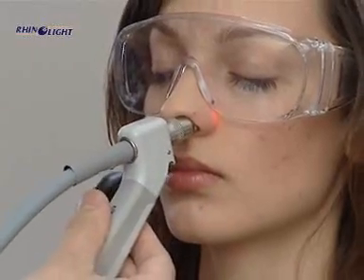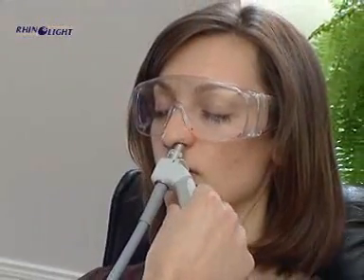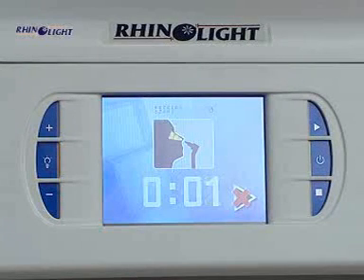During the treatment, the progress can be followed by watching the light shining through the skin of the patient's nose. After lighting up both nasal cavities, the treatment is finished.